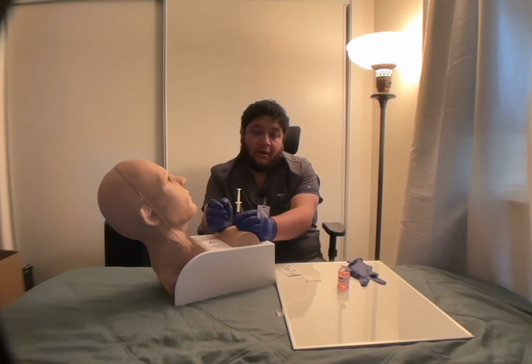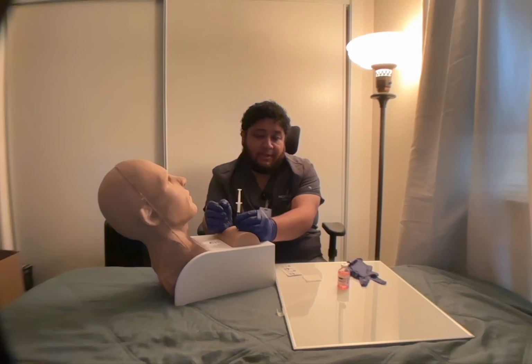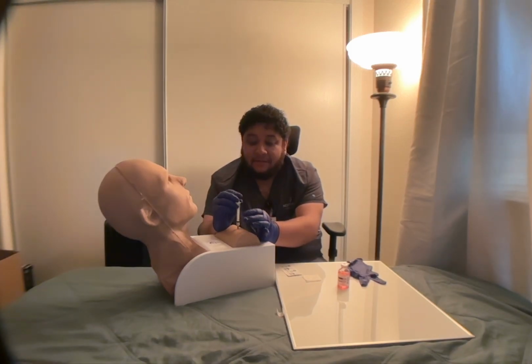Okay, now when injecting the medication, it's going to take 10 seconds per milliliter, so about 15 seconds for the entire medication administration. Okay, now that the medication is administered, I will go ahead and leave the syringe in for 10 seconds.